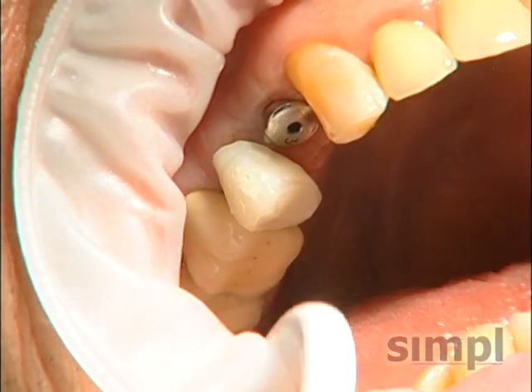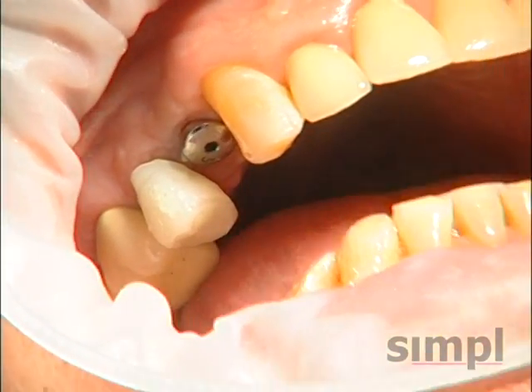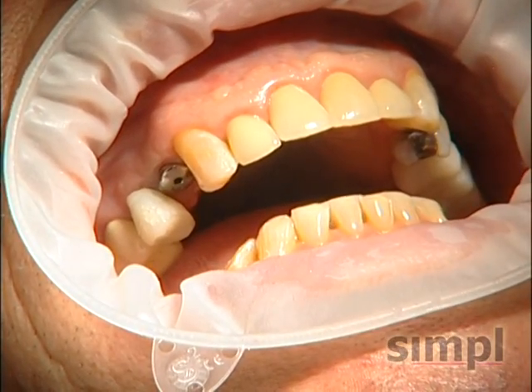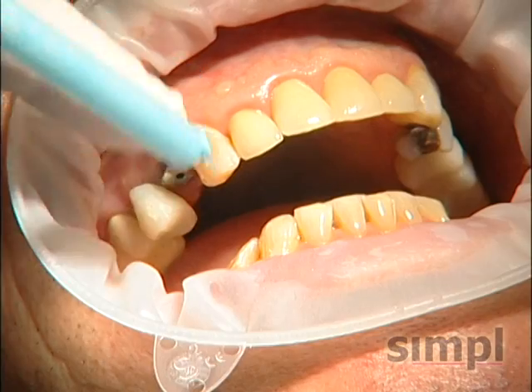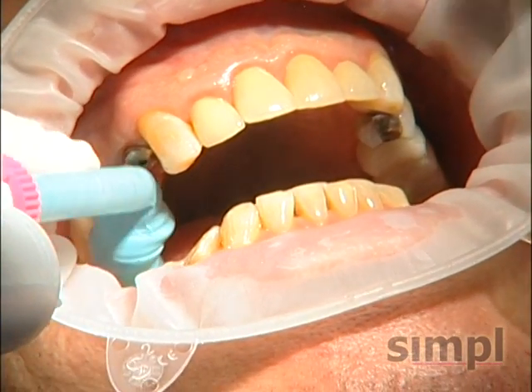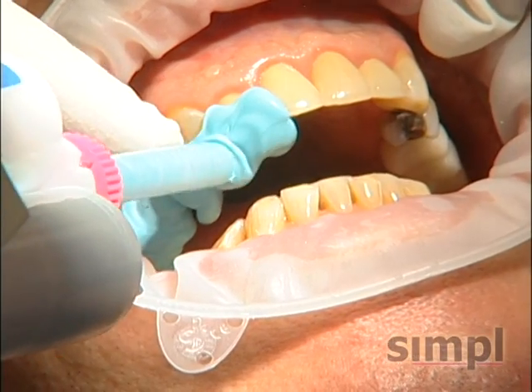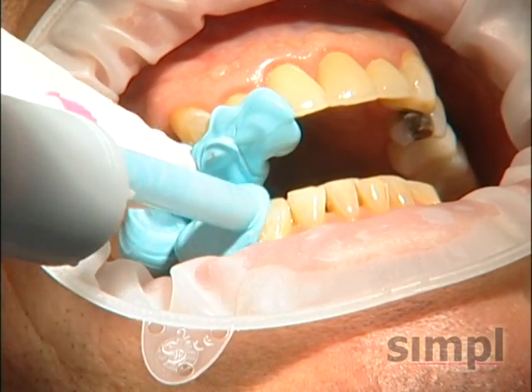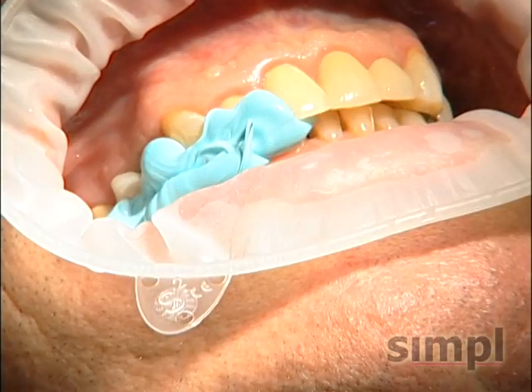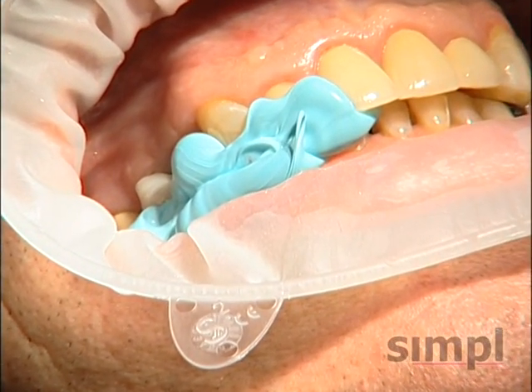Okay, bite again. I'll take the bite now. Okay. And bite down. Close. All the way. Hold that. Okay, then we'll take this off.